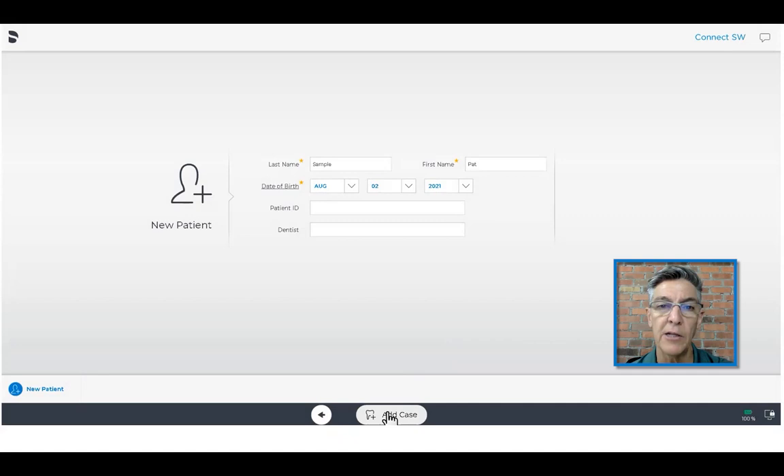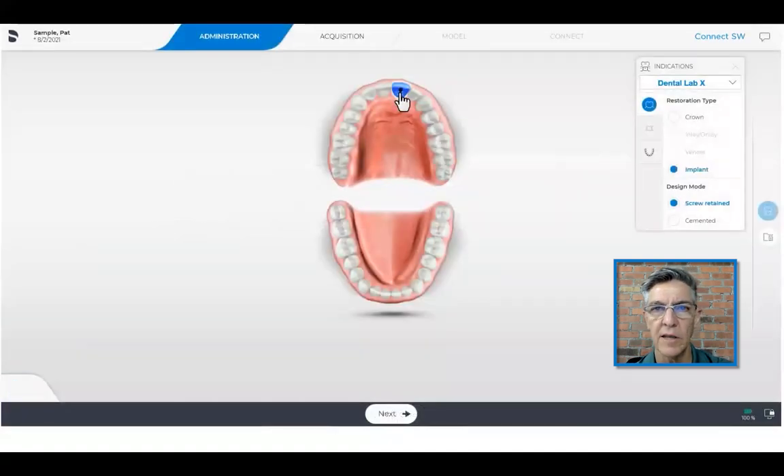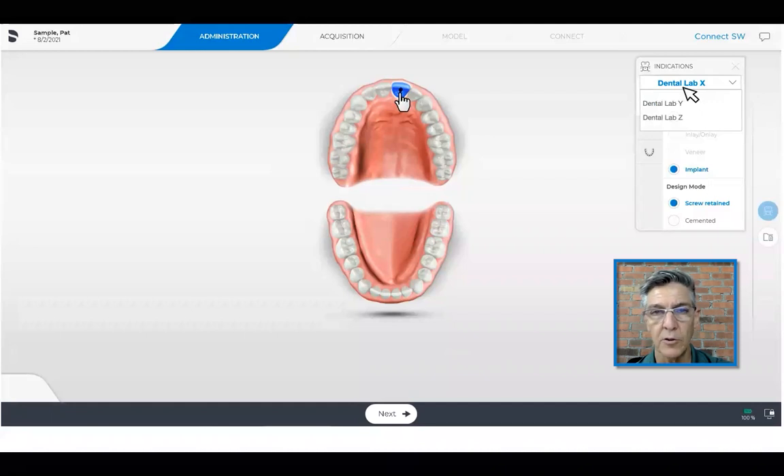Starting in Sirona Connect, we enter patient information and move on to the administration screen. Here, we're going to select where the implant is located, and then we're going to choose the laboratory that we want to send it to. We also click on the implant and the screw retain box to make sure we are ordering the correct abutment.